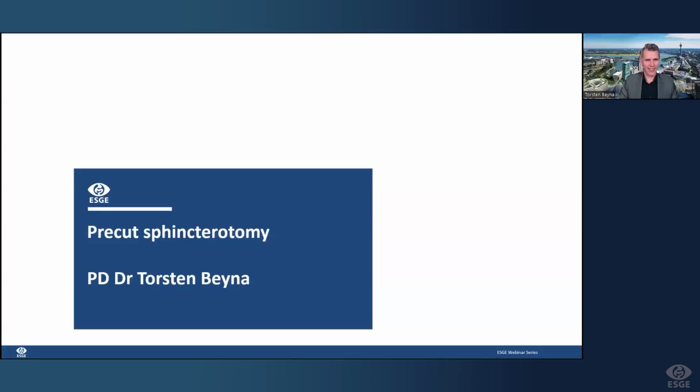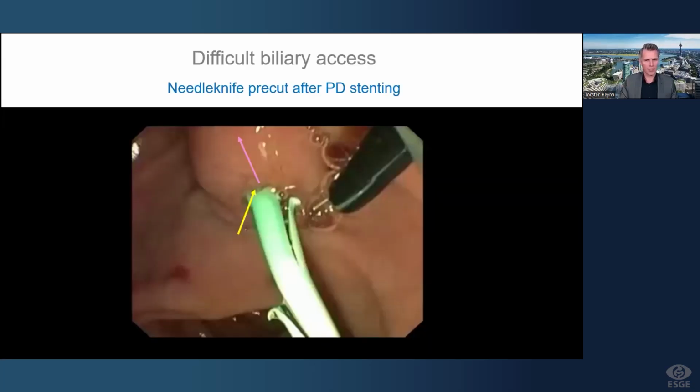So over to you, Torsten, to tell us about Precut sphincterotomy. Yeah, George, thank you. And also to all participants that already asked some questions about Precut sphincterotomy. I think this can be very helpful in our practice. So let's dive into the theory behind it.